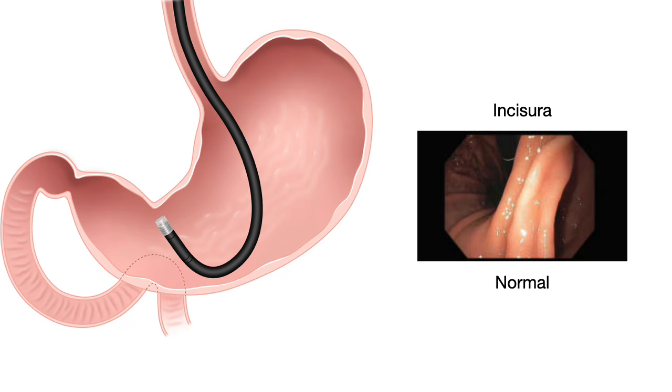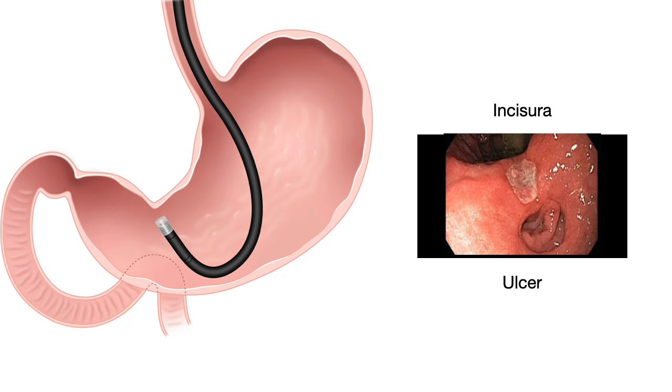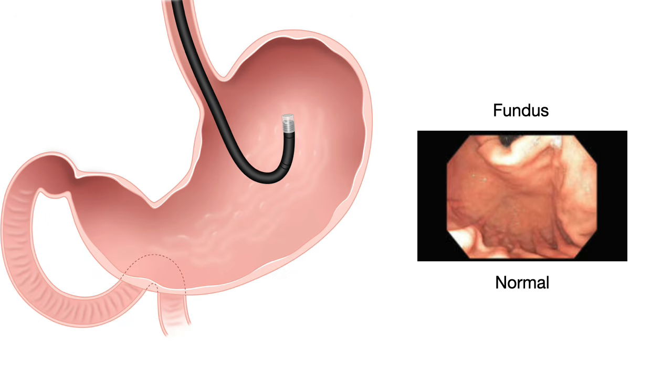So now let us go back to the incisura. Sometimes the incisura can have ulcers, as you can see here. This is an ulcer in the incisura. And then let's get back to the fundus of the stomach.